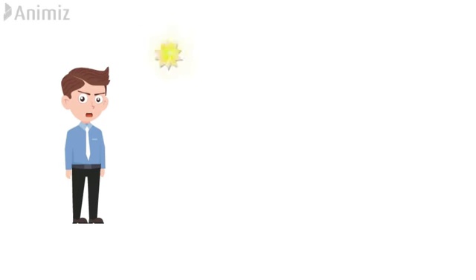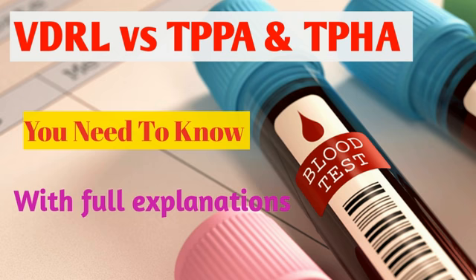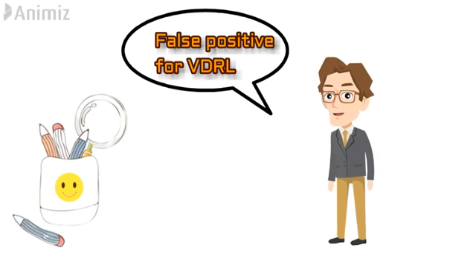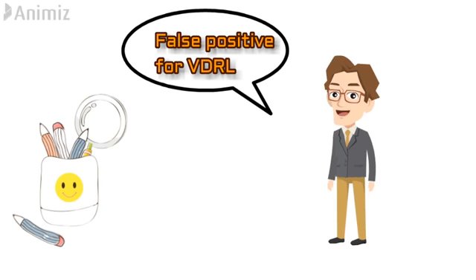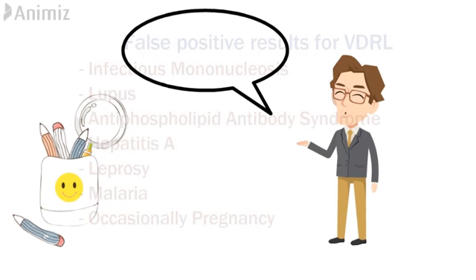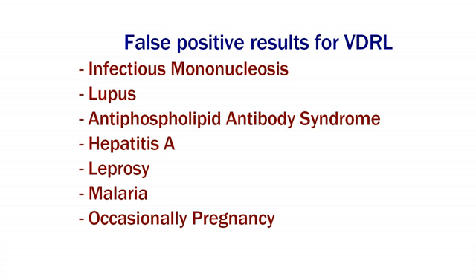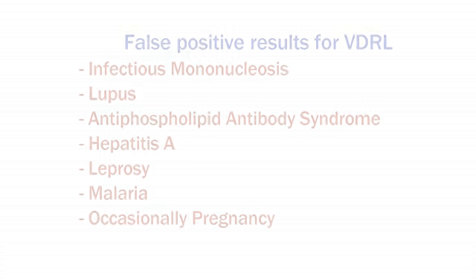Now let's discuss the false positive results of the VDRL test. False positive means a result that indicates a given condition is present when it is not — for example, the patient is not actually having syphilis but their result is showing positive. The VDRL test is sometimes positive in the absence of syphilis. A false positive VDRL can be encountered in infectious mononucleosis, lupus, antiphospholipid antibody syndrome, hepatitis A infections, leprosy, malaria, and occasionally in pregnancy. The RPR and ART tests are similar and can also give false positive results.